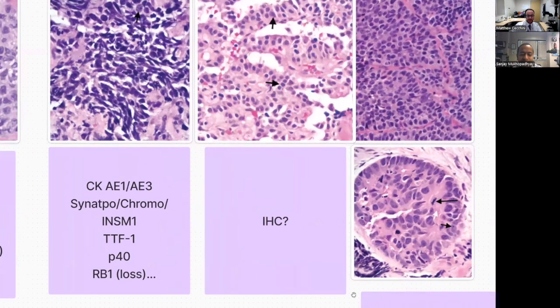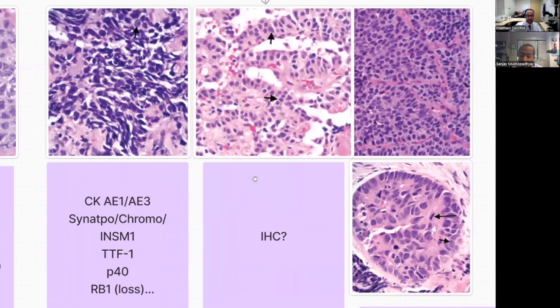So what about a lower grade neuroendocrine tumor on a biopsy? Is that something in the carcinoid spectrum? I think this is also not a clear-cut situation. Like the small cell, if your clinical setting and morphology are perfect, the yield of immuno is so low. In a case that has great morphology like this, a youngish person, never smoker, with a solitary small nodule, I think it's very, very likely to be carcinoid, and you don't necessarily need to do any stains. And on lobectomies, I don't do the stains.